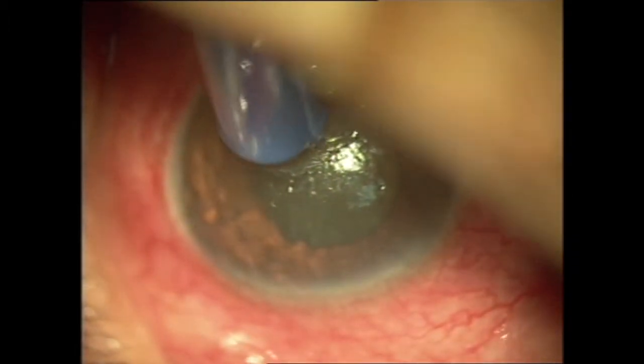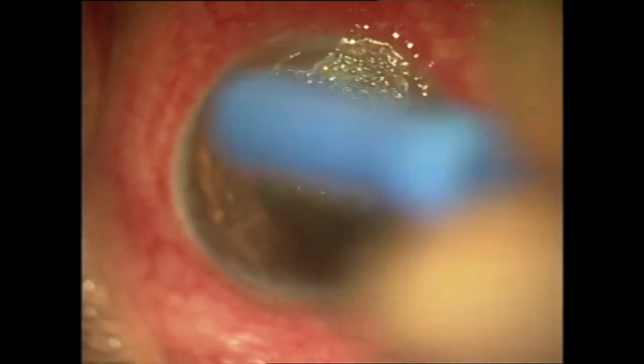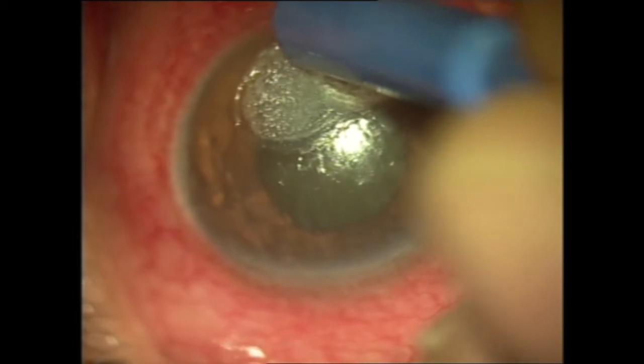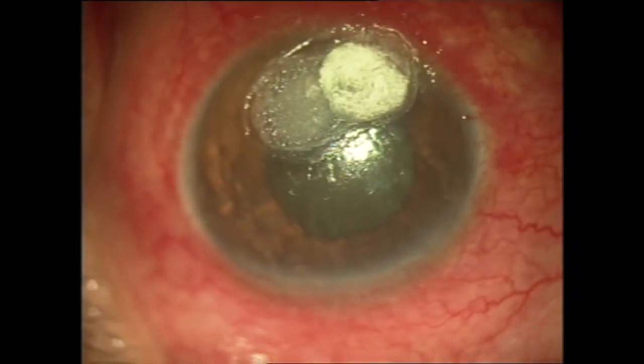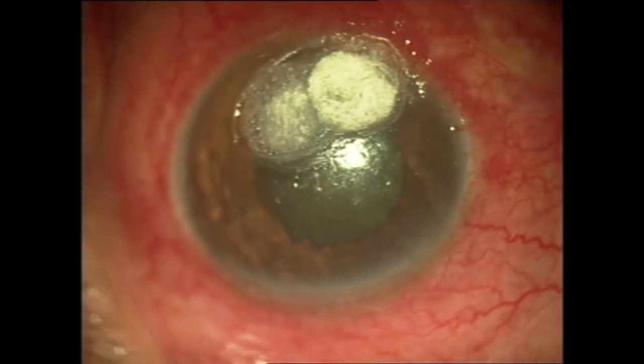Here, the base of the handle of a PVA sponge is used to apply a very thin, uniform layer of cyanoacrylate glue. It can also be applied with a thin needle or cannula. Care is taken to prevent application of too much glue.